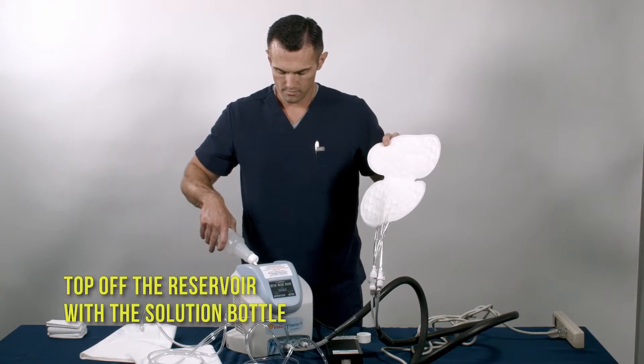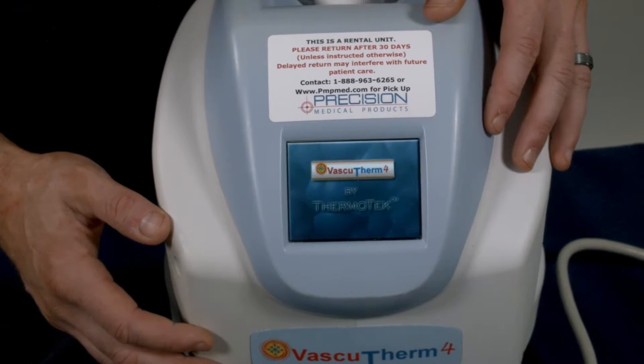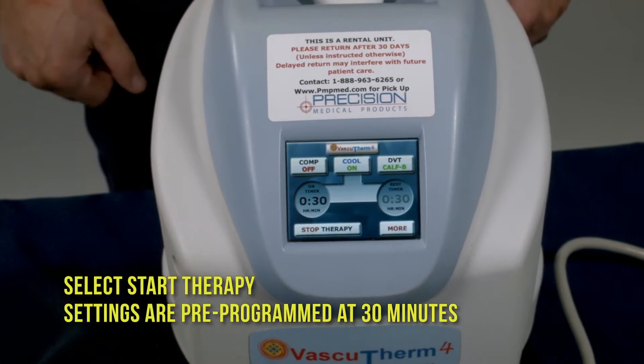Top off the reservoir with the solution bottle. Tap the screen to turn it on, then select Start Therapy. Settings are pre-programmed at 30 minutes.